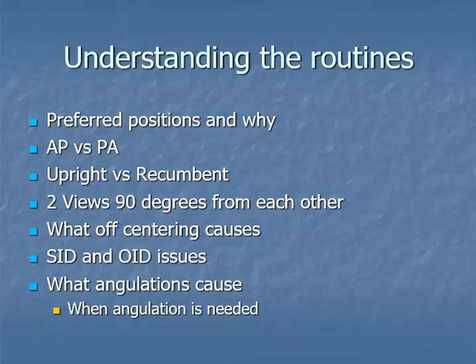AP versus PA. Why do you do AP versus PA chest X-rays? Is there a time that it's appropriate to do AP chest X-rays? And understanding the anatomy and how it's affected by both projections, development, and also pathology helps you to understand when it is appropriate to shoot alternate views.